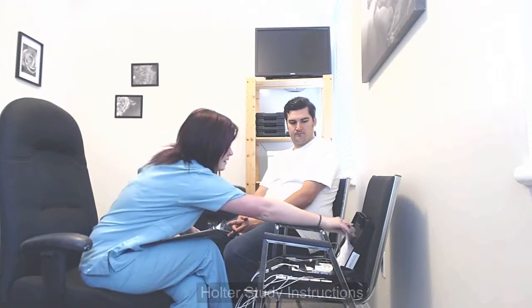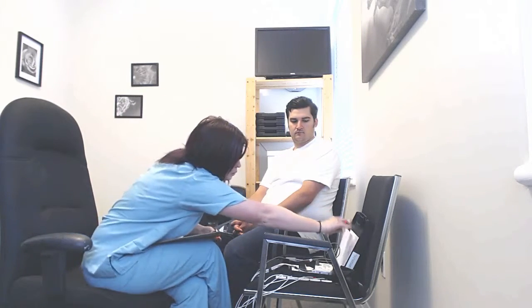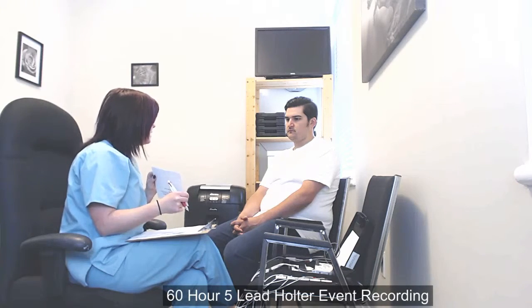In your kit, you will have an overall instruction sheet and your paper diary. Keep your paper diary on you at all times, just in case you are feeling any symptoms, and fill it out as thoroughly as possible. Not only will you be recording any events on the paper diary, but you will be recording on the machine as well using the diary button, and there is a sheet explaining how to record any events.